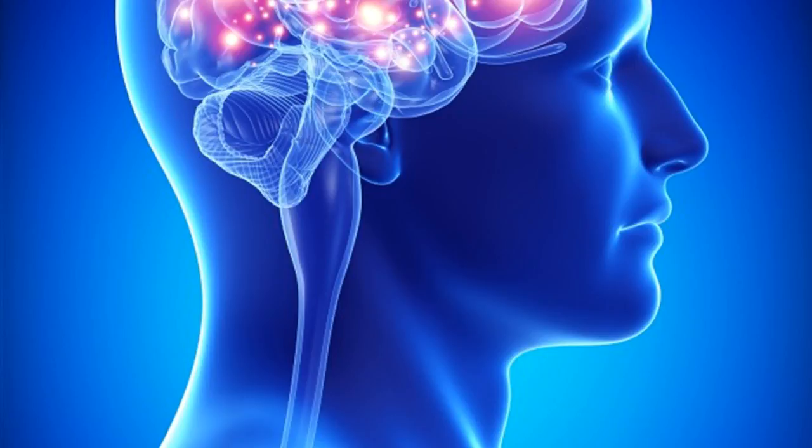You know, people hear of MRI, when they hear of athletes being hurt, they get an MRI. How is that different from fMRI? When athletes get scanned, they get what's called a structural MRI. So we can see the structure of their knee or elbow or something like that.